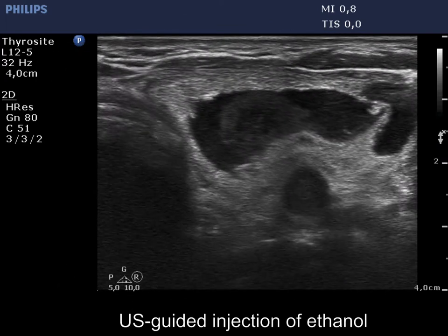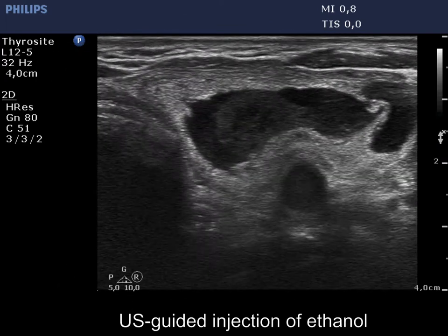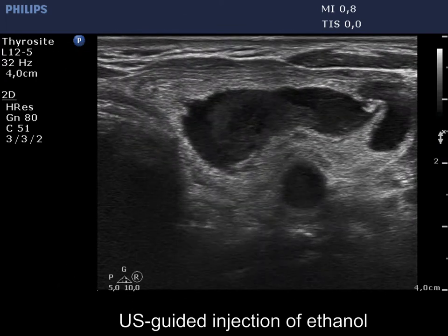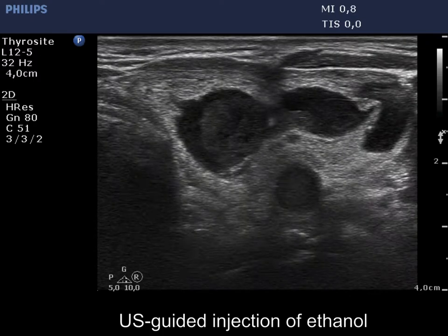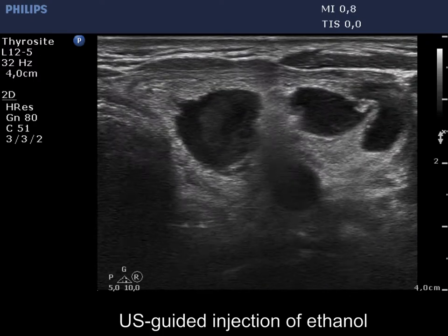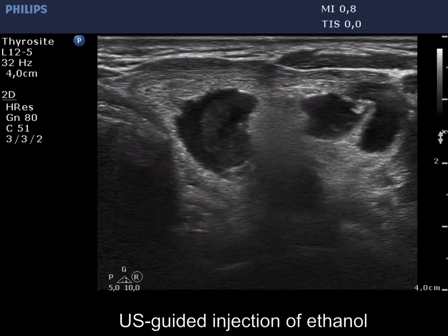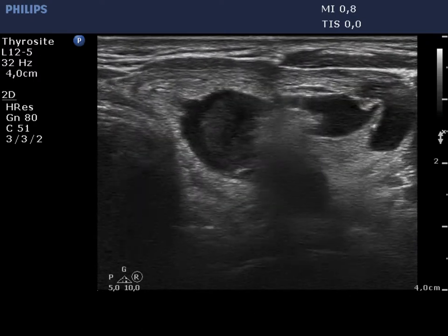Now, the ethanol injection is shown. As soon as we noticed the tip of the needle, we started injecting alcohol.